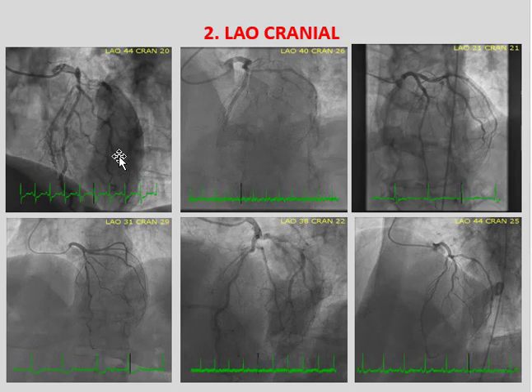Before, the LAD was going diagonal in the straight cranial. What we've done here is tilted the camera to the LAO, the patient's left. We've moved from the cranial to the LAO, so we've dragged that LAD across to the left. In the straight cranial, the LAD was diagonal, like that, top left to bottom right. The LAD is now much straighter and slightly to the left, more accentuated to the left in these two shots.